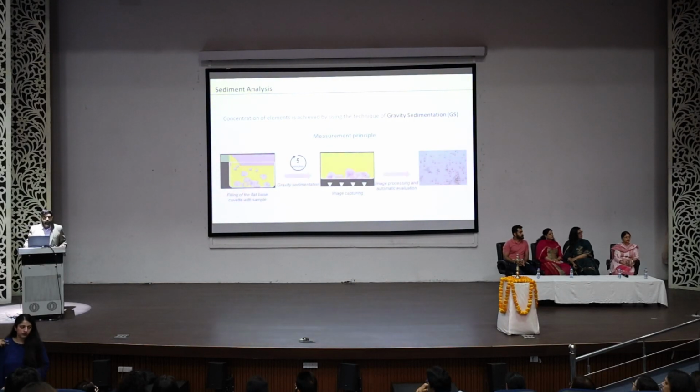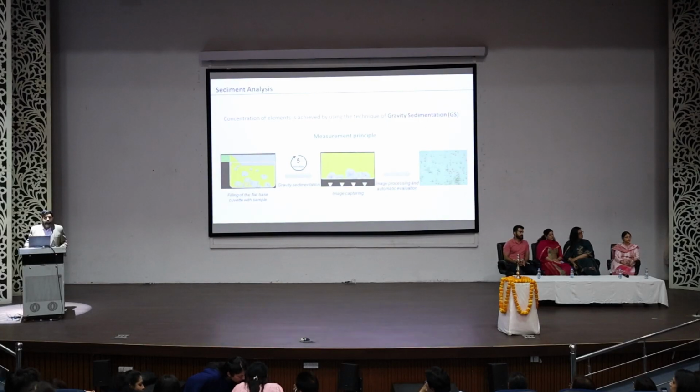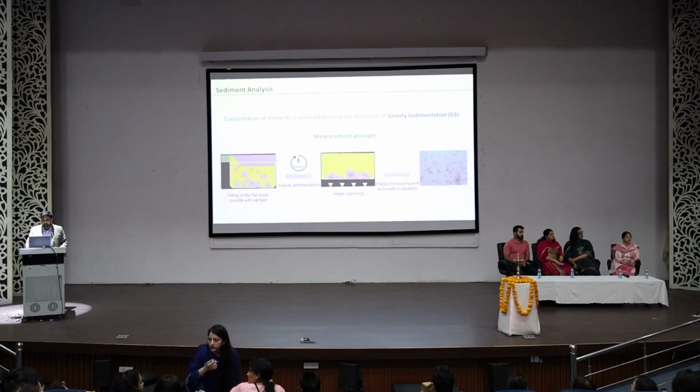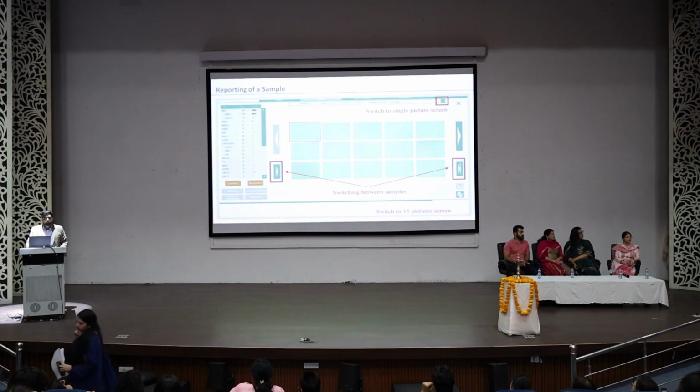As the gravitational force is applied, the larger the size, the greater the weight, so the sample will settle at the bottom. Simultaneously, the digital microscope will read the sample. This is best for diagnostic institutes, as the technician can continuously observe the sample on the screen. If you watch that screen, you can continuously monitor whether the sample is giving a right or wrong result. This kind of screen you will be able to see in the instrument.